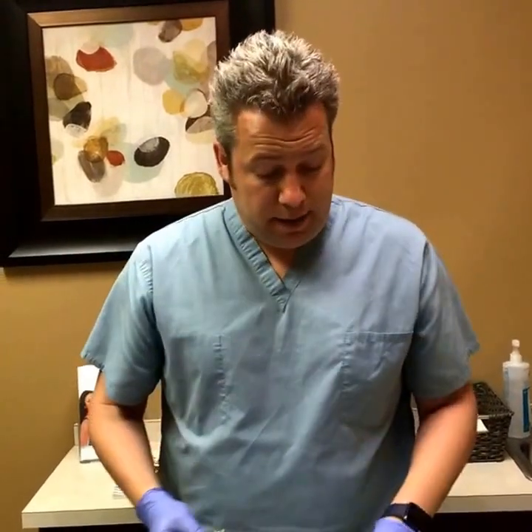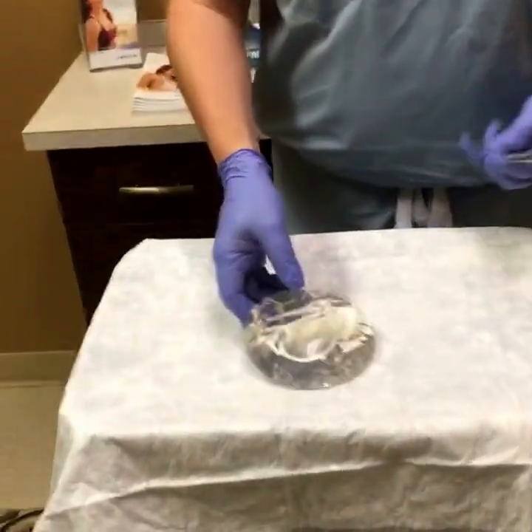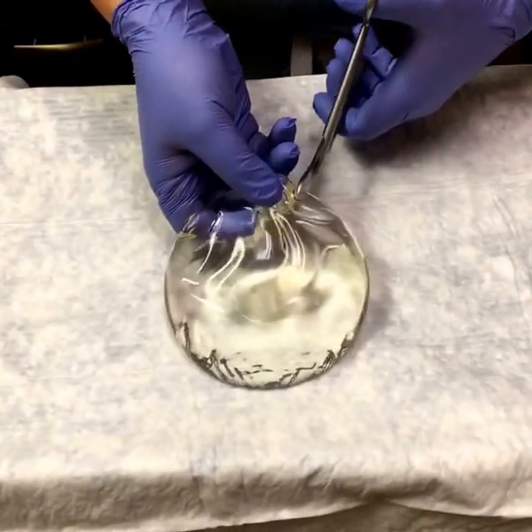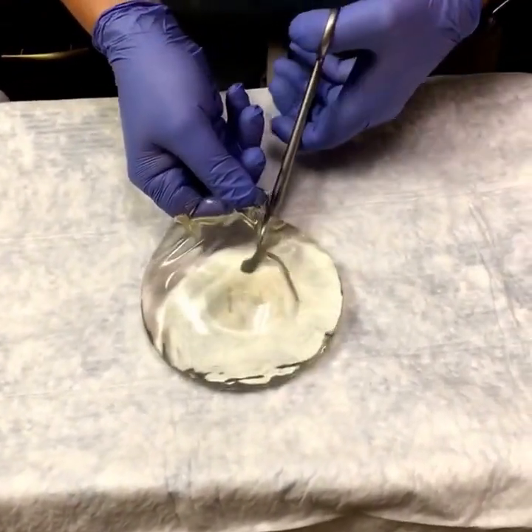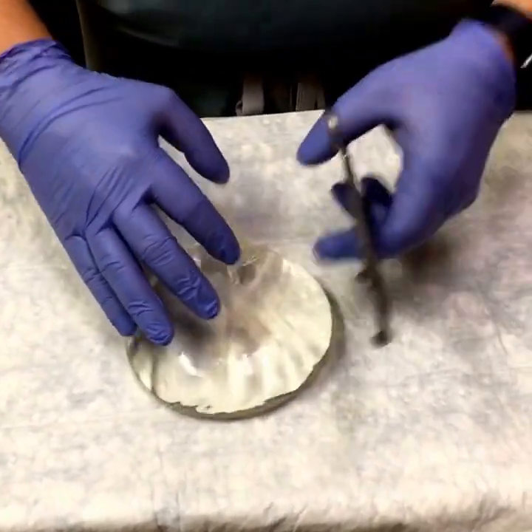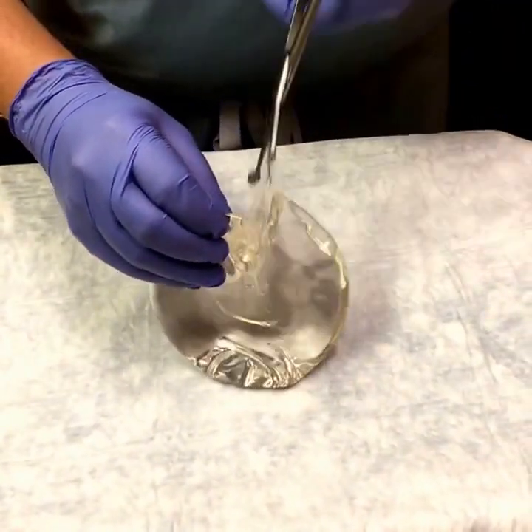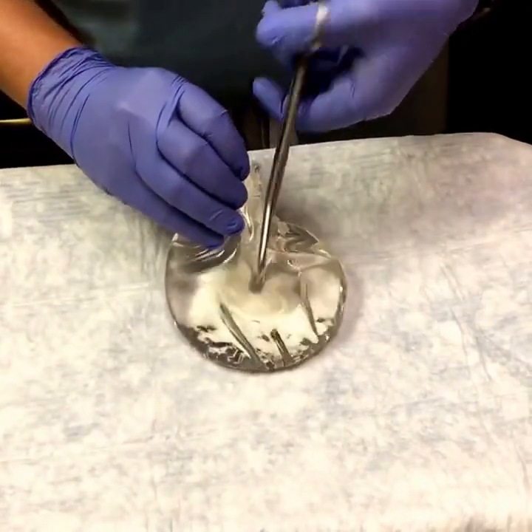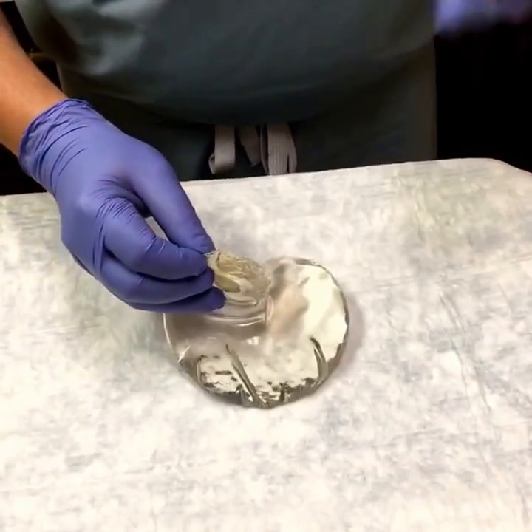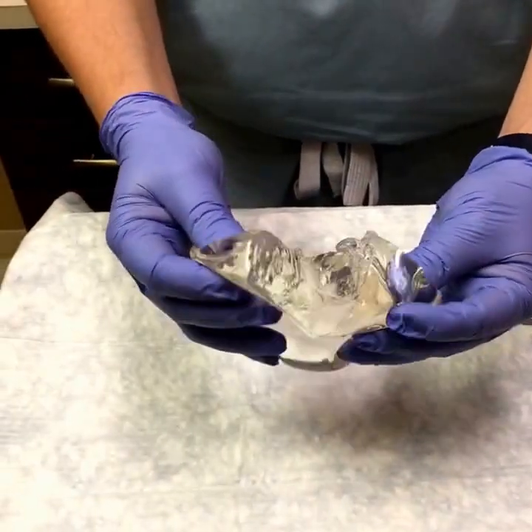I've got my gloves on, I've got my trauma shears here, and Amy's going to bring the camera in close as we go ahead and cut this thing in half. Without further ado, let's do the cutting — and here we are. As you can see, the silicone does not run all over the table like maple syrup. The silicone sticks together and likes to stick to the shears a little bit, but as you can see we have cut into that implant and it holds its shape.